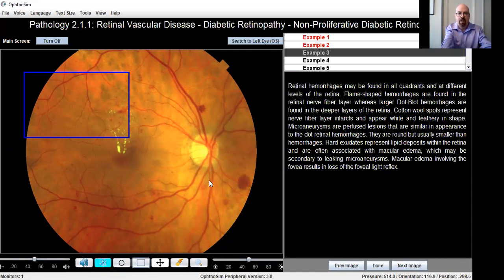So here, I've activated the icon, and we're going to go over to this hemorrhage, and I've created a simple box around that. Once again, pressing the left part of the mouse and dragging it over. We'll go ahead and erase that. And here we can do it also from the bottom. So I'm pulling it over and up.